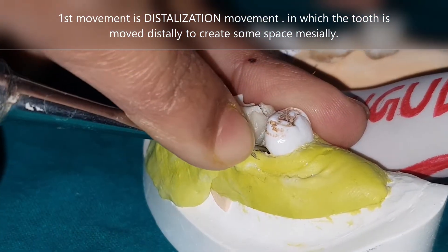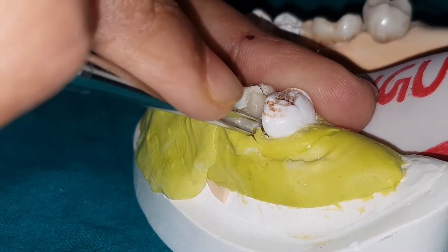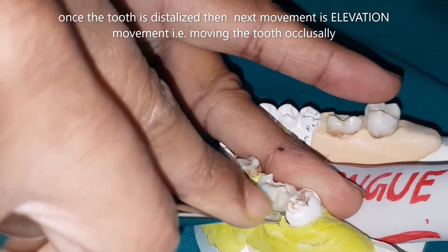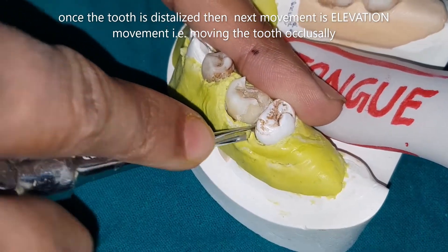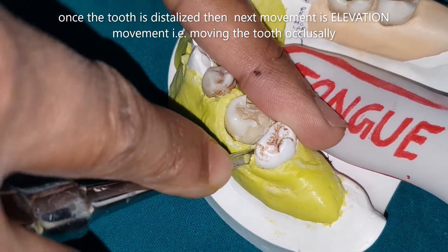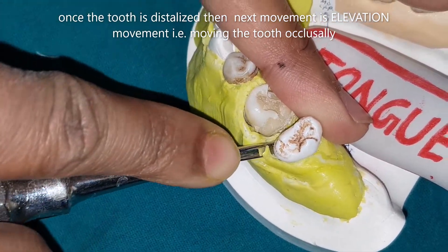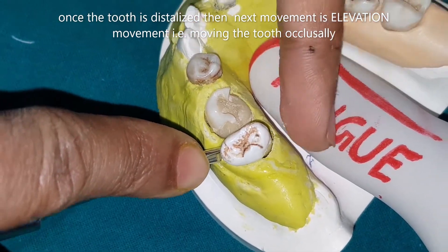The tooth is now more distally positioned. Next is elevation: taking the buccal alveolar bone as fulcrum, you apply the lever and fulcrum principle and start elevating the tooth upward. Make sure the entire force generated is supported by the buccal alveolar bone, as you can see here.